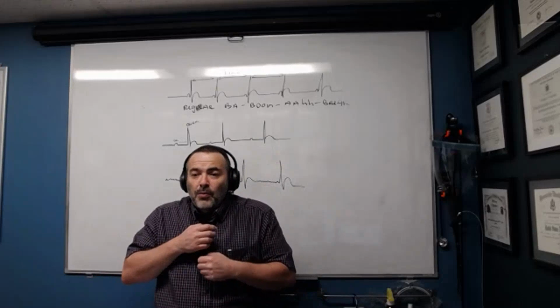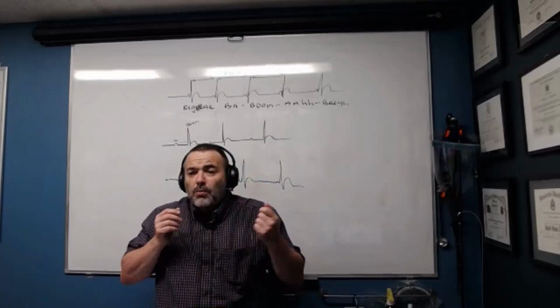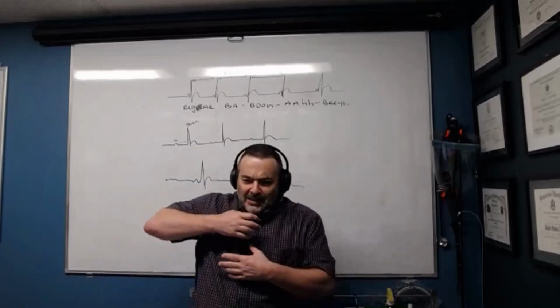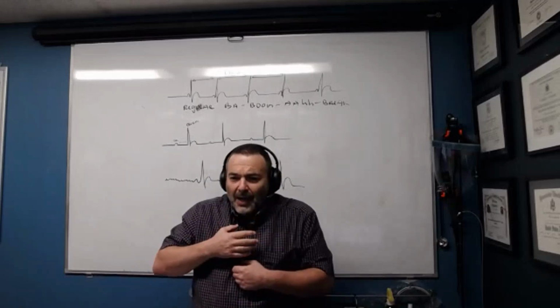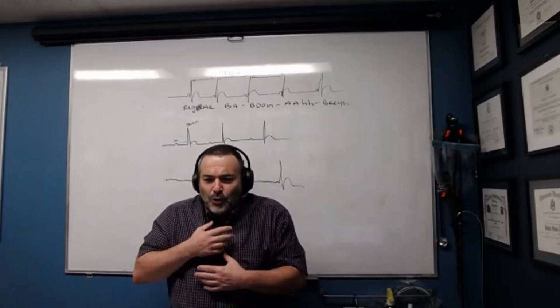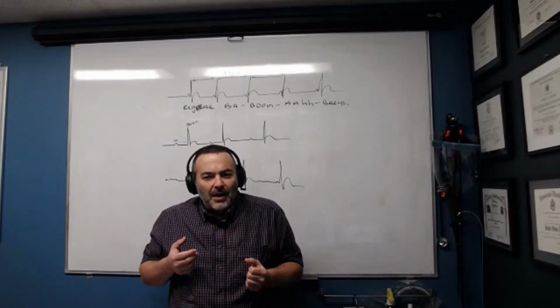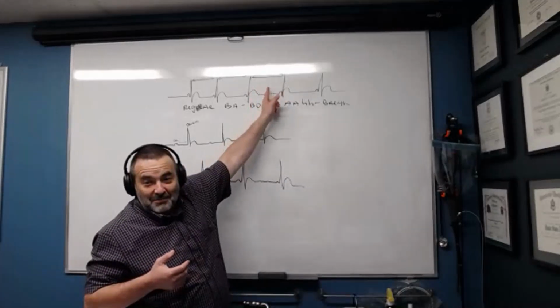Instead of ba boom, it sounds like ba boom, ba boom. So it looks like the top section of the heart is not going ba boom. It's shaking, it's shivering. So the top portion of the heart is shaking, it's shivering. Is that normal? No, that's not normal.